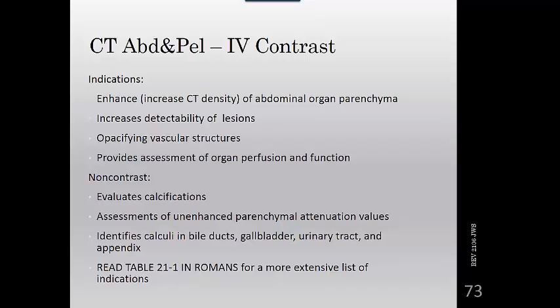Air and water are excellent as low attenuation contrast agents. Air or carbon dioxide is frequently used to insufflate the colon for CT colonography, which produces a very high negative contrast. Water or low Hounsfield unit oral barium sulfate suspension, such as VoLumen, is sometimes used in place of the positive contrast agents. And these low Hounsfield unit agents will not obscure mucosal surfaces or superimpose abdominal vessels on the post-processed images.